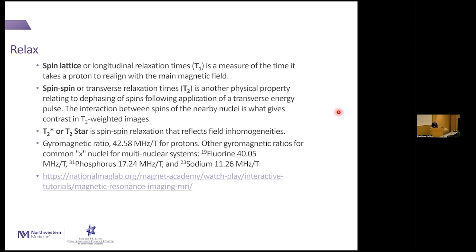And then T2 star is a little bit more complicated. That's where it interacts with local magnetic inhomogeneity. So I'm not going to get into that.